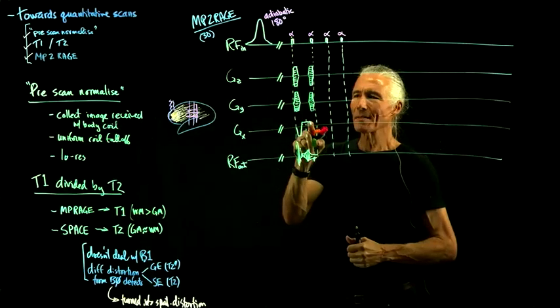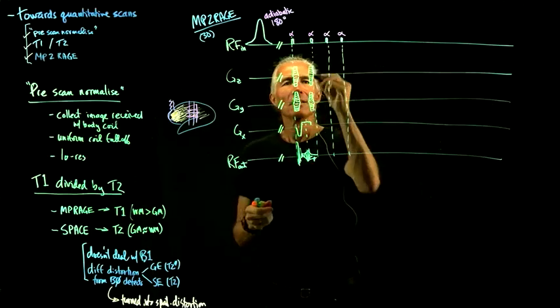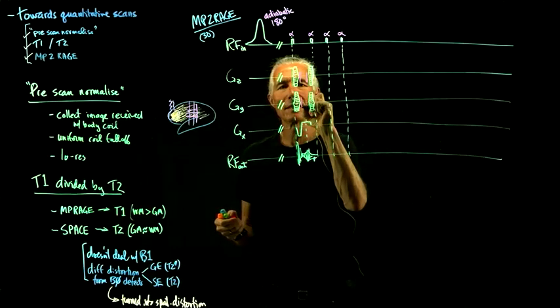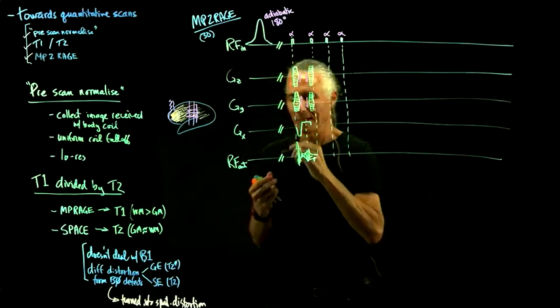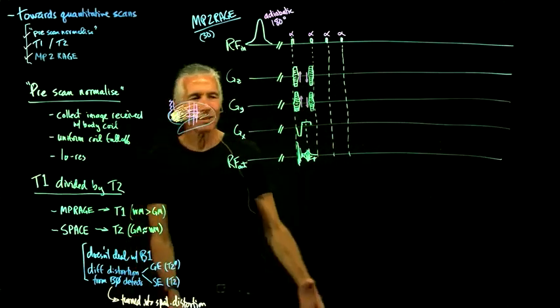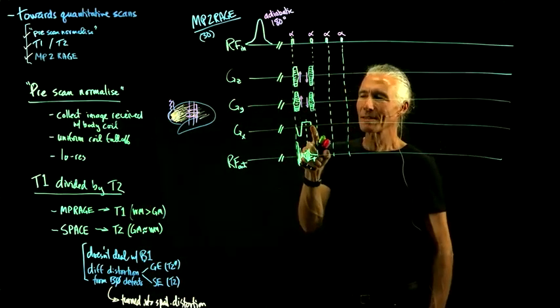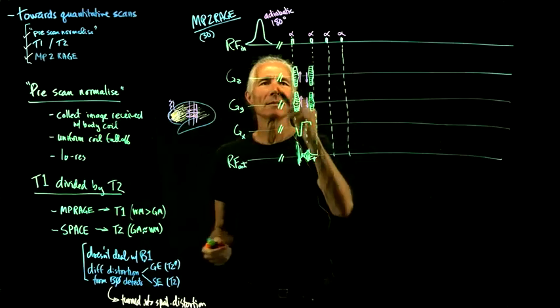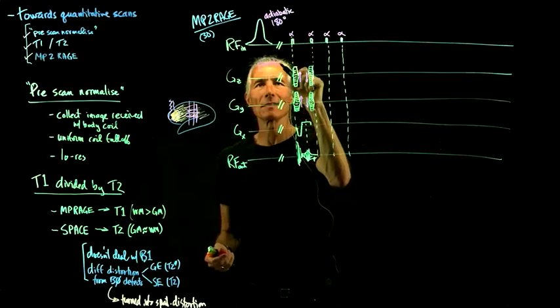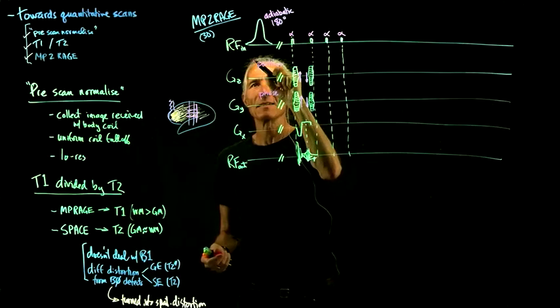Now, we know that in the case of the coherent scans that sort of fix it all up, we'll do it this way over here and then just undo whatever you did, that changes the contrast. But this still looks like a regular incoherent scan. And so why is that? It's because we haven't fixed the readout. So this is the partition direction or second phase encode direction, and this guy is the phase, and this guy's the readout.